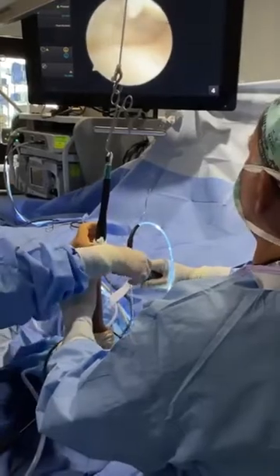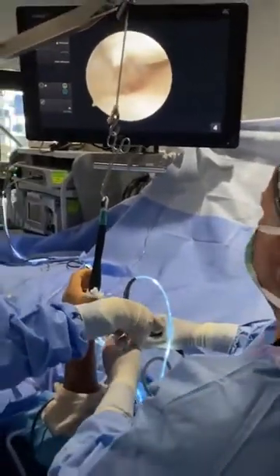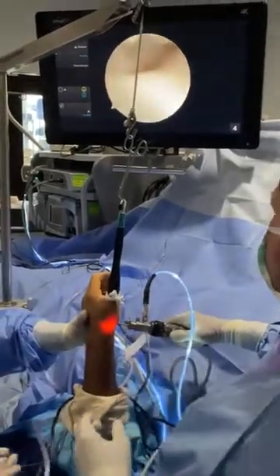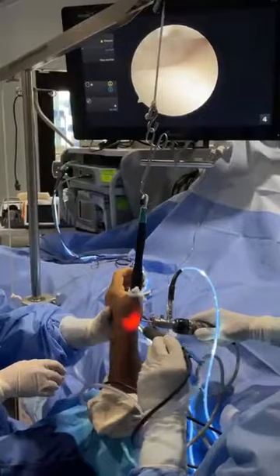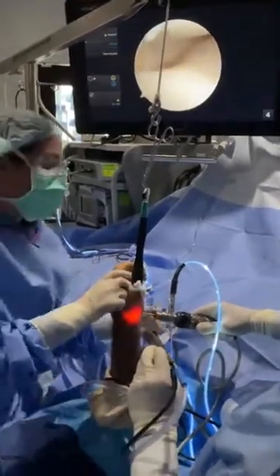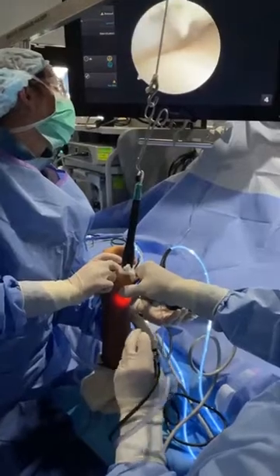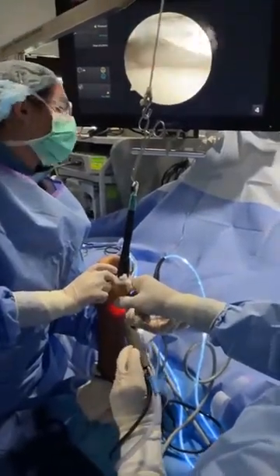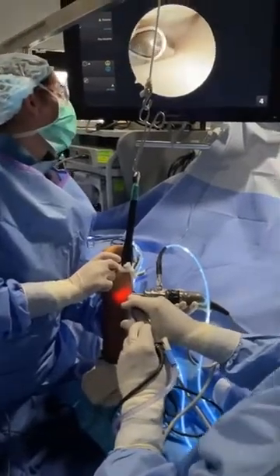Here's the redundant capsule right there — you can see this part of the joint still needs attention. These small joint arthroscopies are kind of a two-person surgery, so Kate knows to grab the camera because sometimes I need two hands.